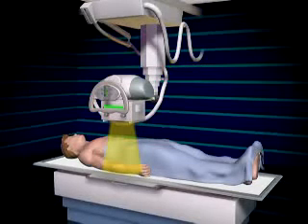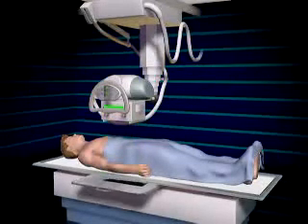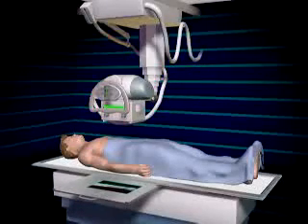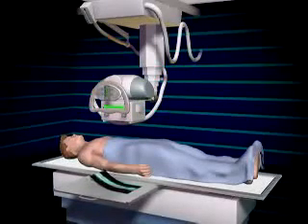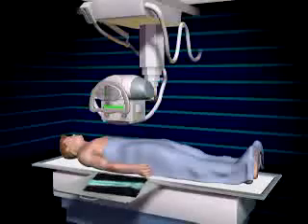As the X-ray energy passes through the patient's body, the photons of the beam reach the film and cause a chemical reaction. The areas where X-ray energy passes through the body become black, while the areas where energy is absorbed by the bones appear white.